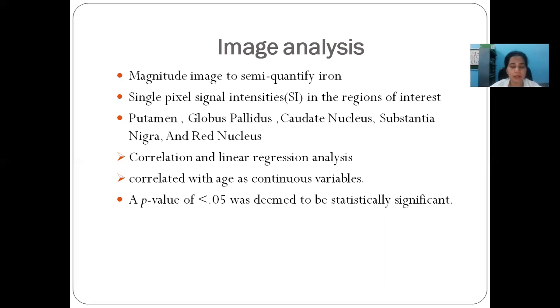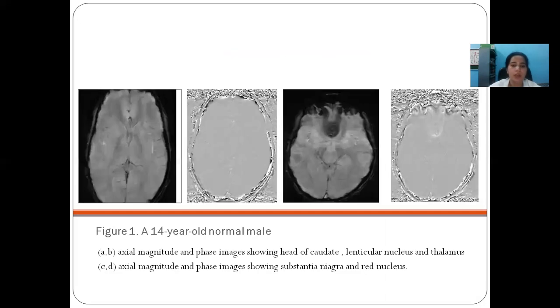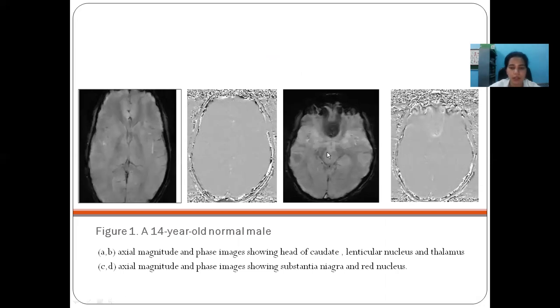Correlation and linear regression analyses were made correlating with age as a continuous variable, and a p-value of less than 0.05 was deemed statistically significant. These are the actual magnitude and phase images of a 14-year-old normal male showing subtle hypointensity in the globus pallidus, substantia nigra, and red nucleus regions. In the corresponding phase images, we can see hyperintensities in the respective regions suggesting iron deposition.